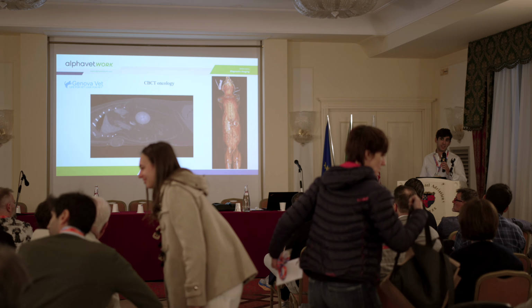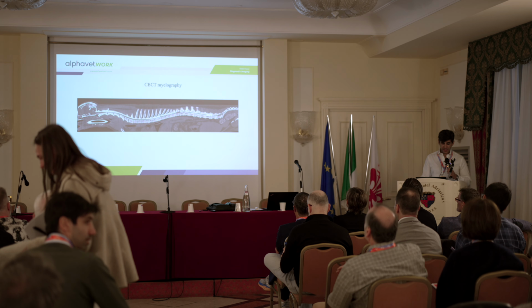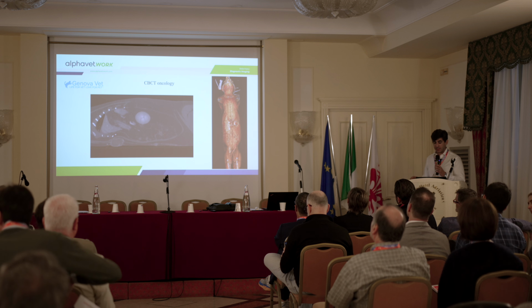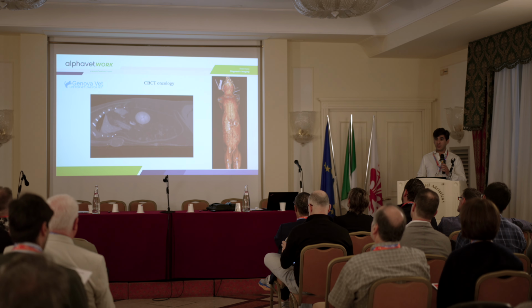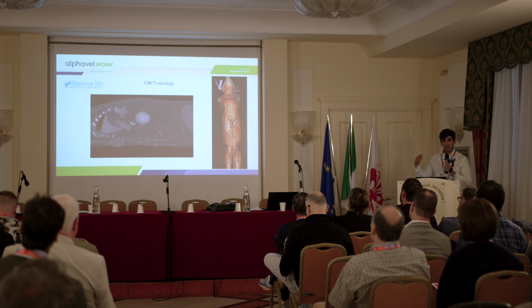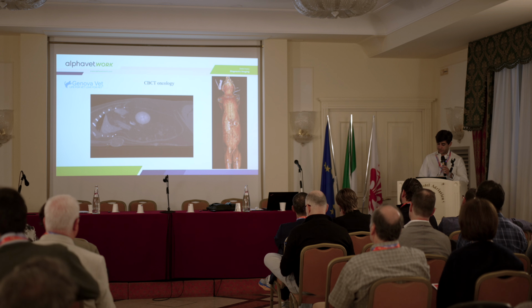What we will ask for a lot is a whole body CT for neoplasia. This is a nice case from Genova Vet, from colleagues who are using that to scan the whole patient. They have mammary gland tumors, and you can see the metastases in the abdomen and in the lungs, so you have the full staging of the patient. This is something I will show to you, and in the next few years we will demonstrate it in the literature. So it has to be evidence-based.